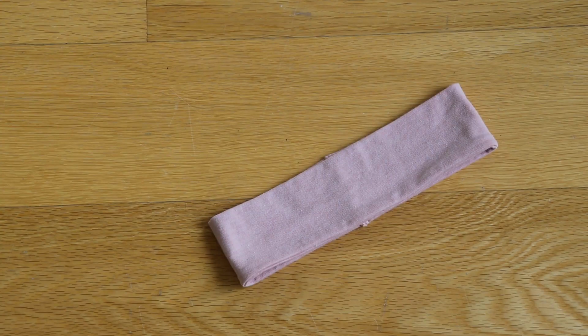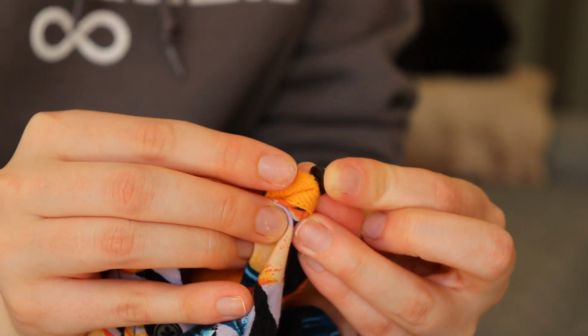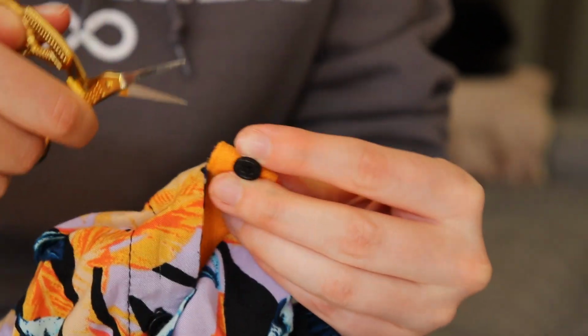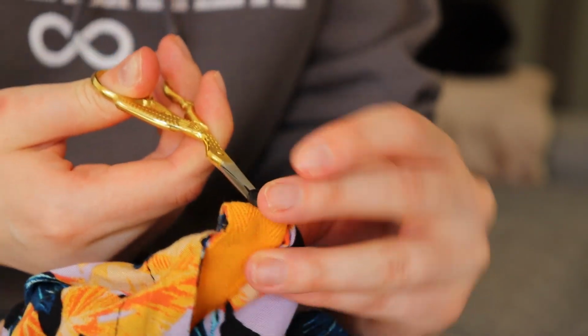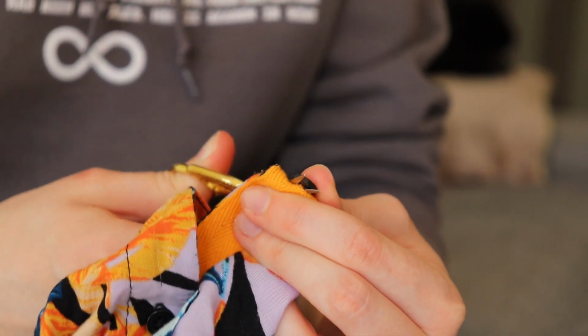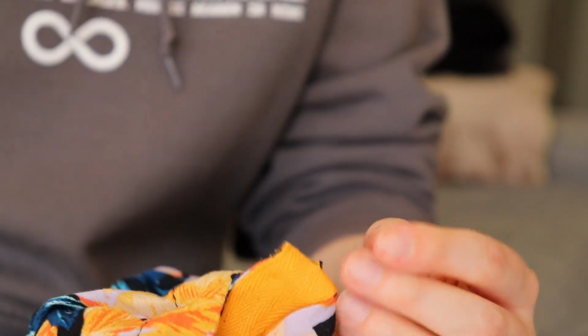So what you're gonna need for this is a headband, two buttons, which if you can find, I do recommend bigger buttons than this, but sometimes you gotta work with what you got. You will also need a needle, scissors, some thread, and a pen. So like I said, I'm working with what I have in my home, so I did just pull these buttons off of an old shirt that I was going to donate anyway. If you are also doing this, just make sure that you are really careful as to not cut yourself when you are removing the buttons off of clothing so that you don't give your nurses and doctors a whole other problem.